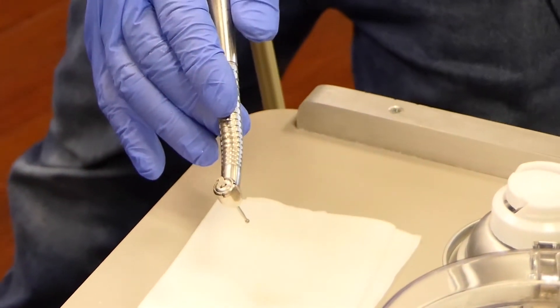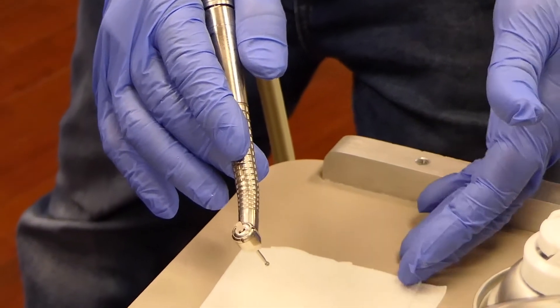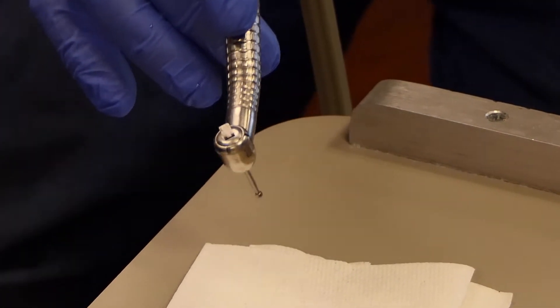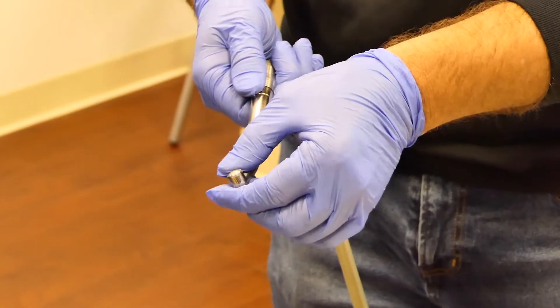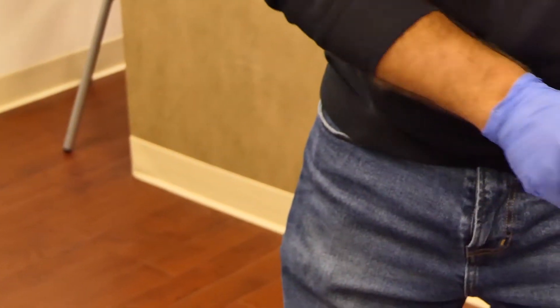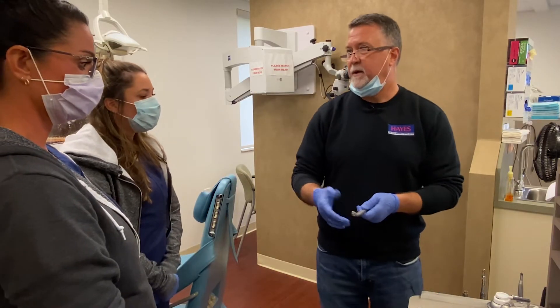Over a paper towel, I'll go ahead and run that handpiece. You can leave the water off — it's a little easier and doesn't impact anything. Over the paper towel you'll see the excess lubricant coming out, and it also expels the debris that's built up in the head. I like to run these for a good 25-30 seconds. Once done, remove the burr — we don't want to sterilize with a burr in it — close the latch lever, remove the handpiece from the hose, wipe off any excess lubricant with the rubbing alcohol two-by-two, bag it, and sterilize.